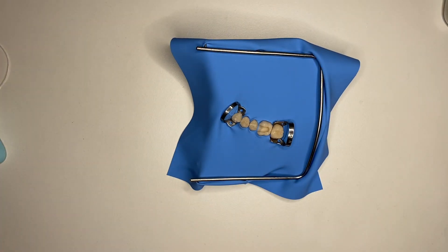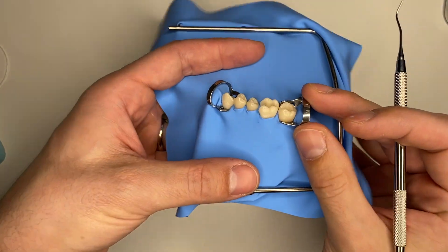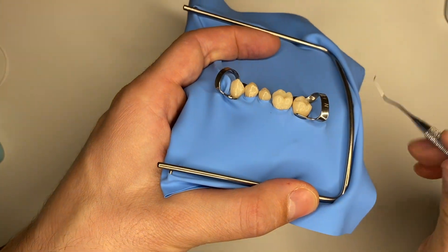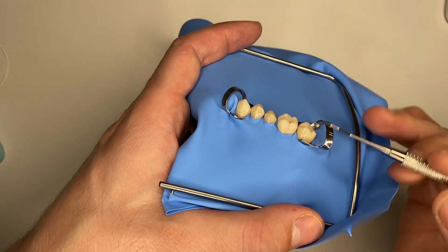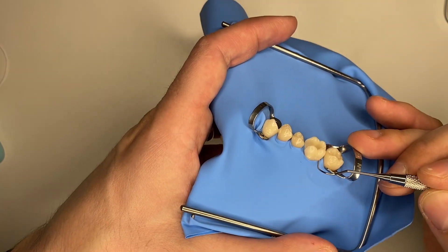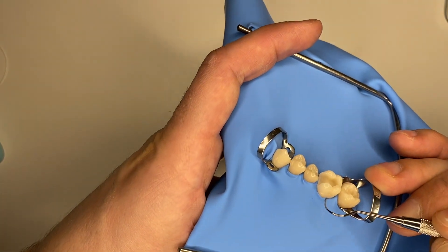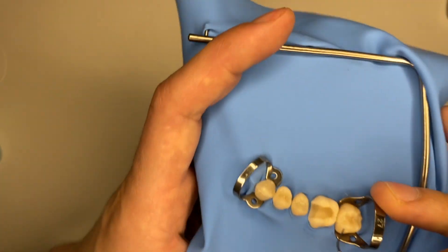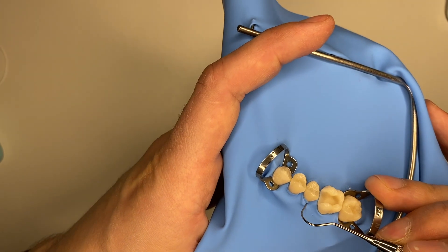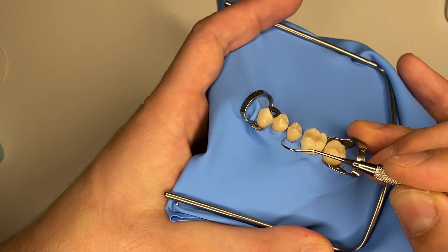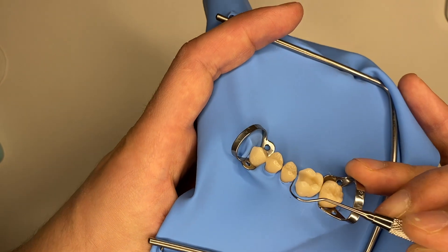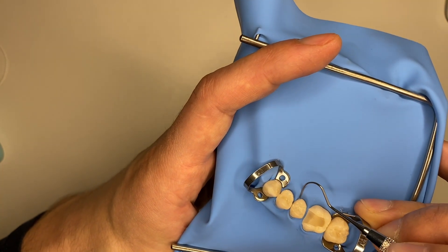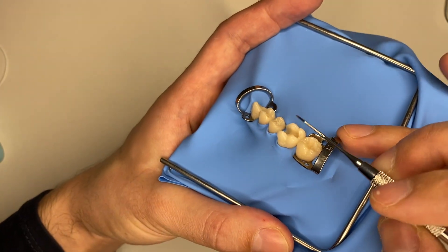Since I'm not happy with the way the rubber dam is seated around the teeth, I can use a metal probe. You can just gently go around your tooth and this is going to cause the rubber dam to invaginate immediately. If your rubber dam is invaginated properly, it's not going to allow any sort of marginal leakage.